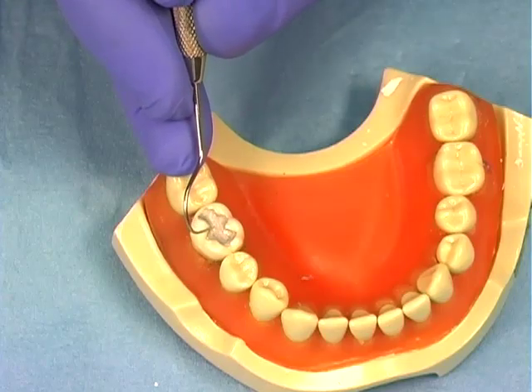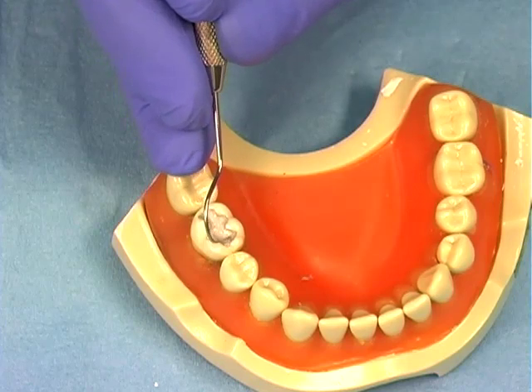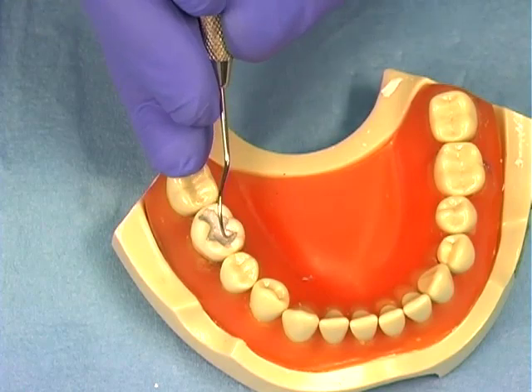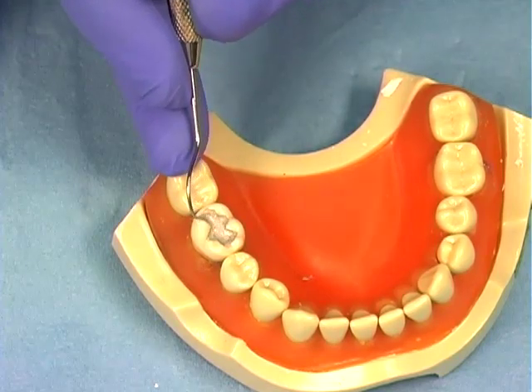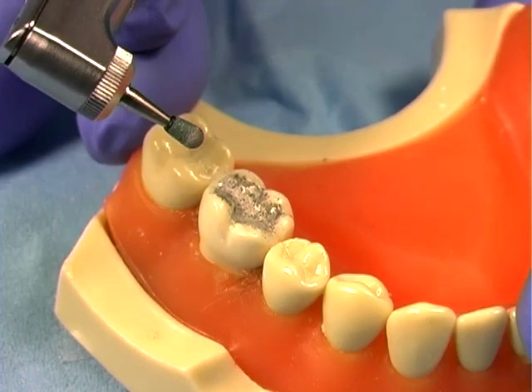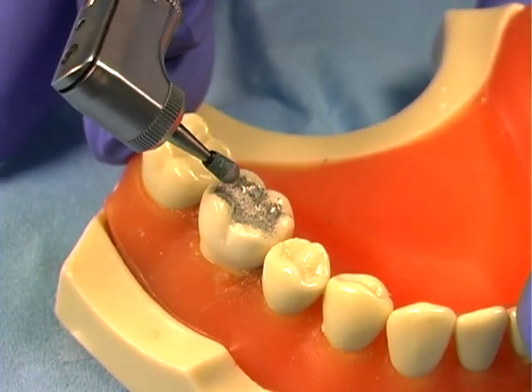Examine the amalgam restoration with an explorer to detect any rough surface anatomy or margin defects. If the restoration has a rough surface, use the green stone to smooth out the defects.